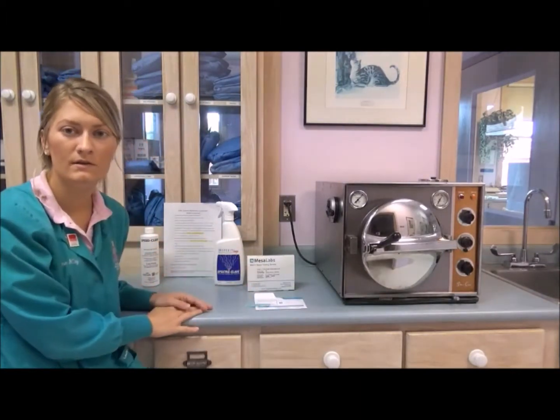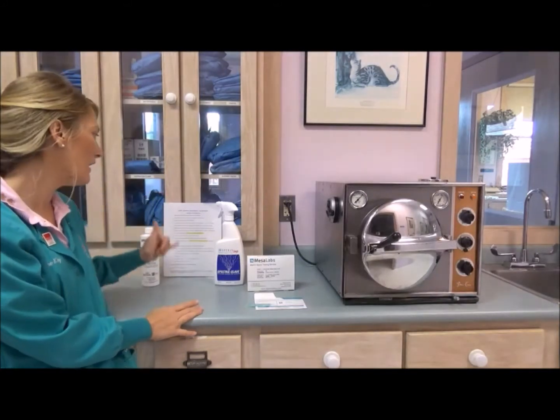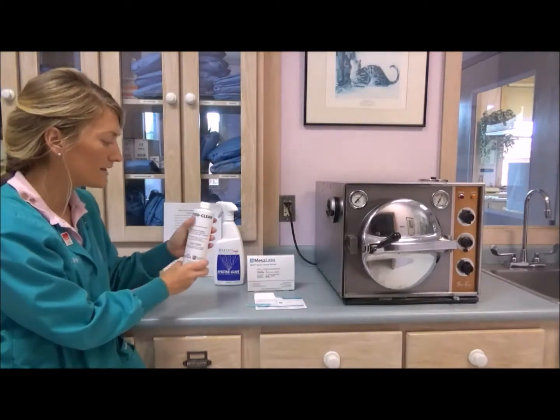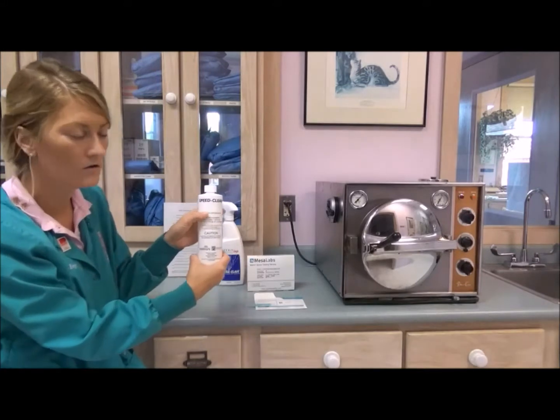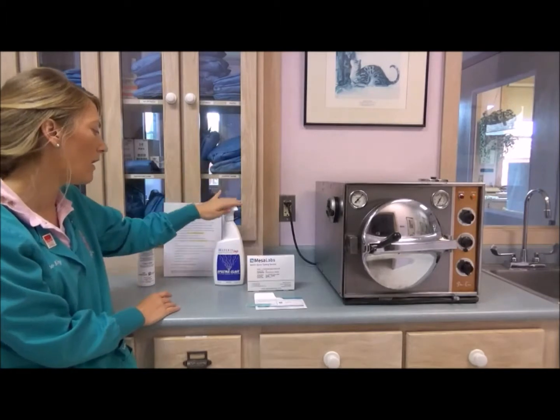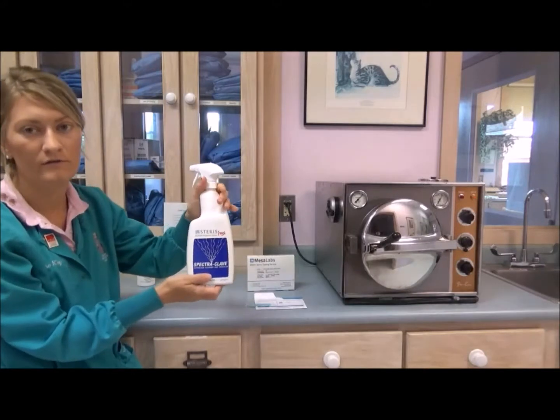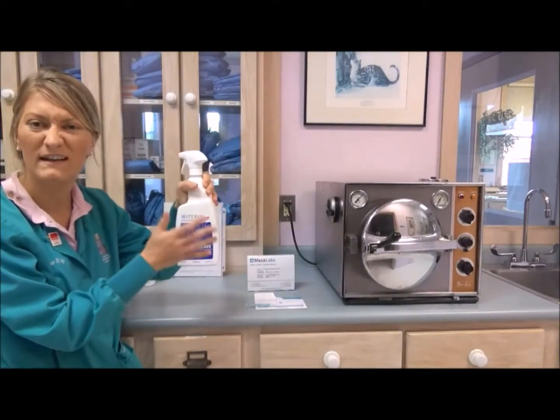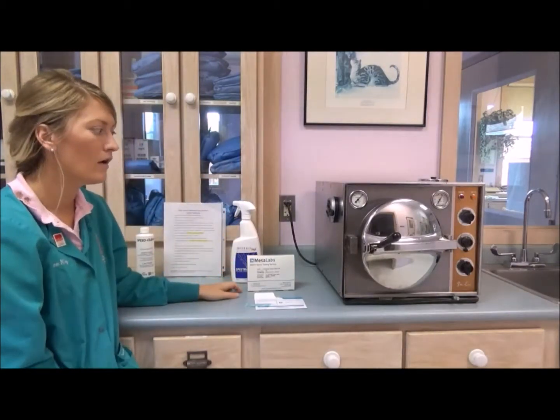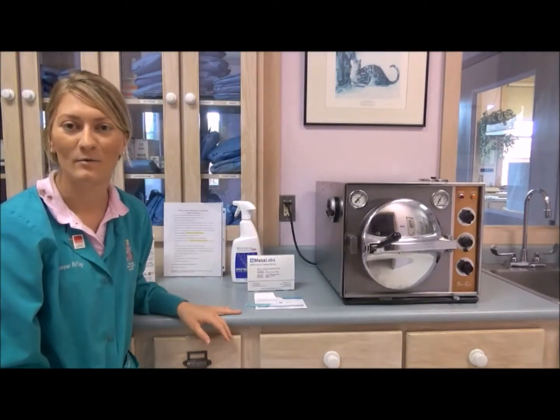Another thing you want to do is you want to routinely clean your autoclave. So once a month, we actually have a monthly maintenance cleaning protocol. So we'll run a cycle through the autoclave using the Speed Clean autoclave cleaner. And then after that cycle is done, then you follow up by spraying inside the chamber with the SpectraClave. It's an autoclave cleaner and descaler. Then you have to let that sit for a little bit, and then you take a wet towel and clean the inside out. So yeah, it's really important. You know, if you take care of things, they will last.